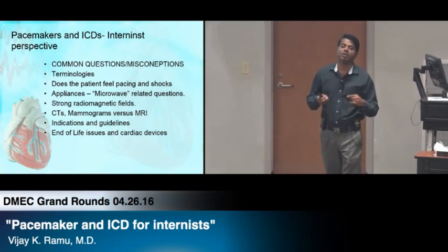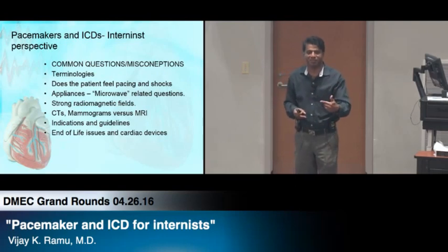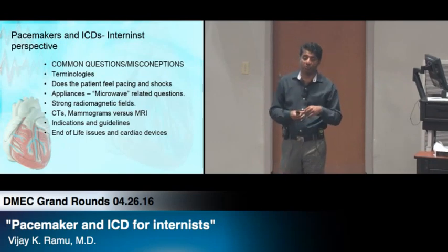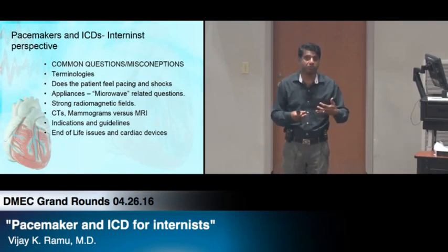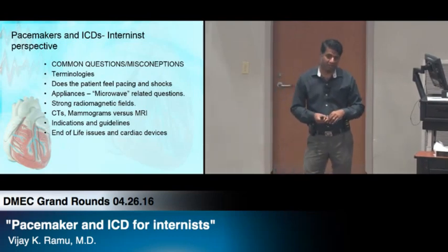Why should you know about it? When you talk about putting a defibrillator in anybody, that is part of the discussion before you put it in. If things were to go wrong, you may get shocked and you will probably feel it. Because patients, when they get shocked, say, you never told me about this, I would never have gotten an ICD.